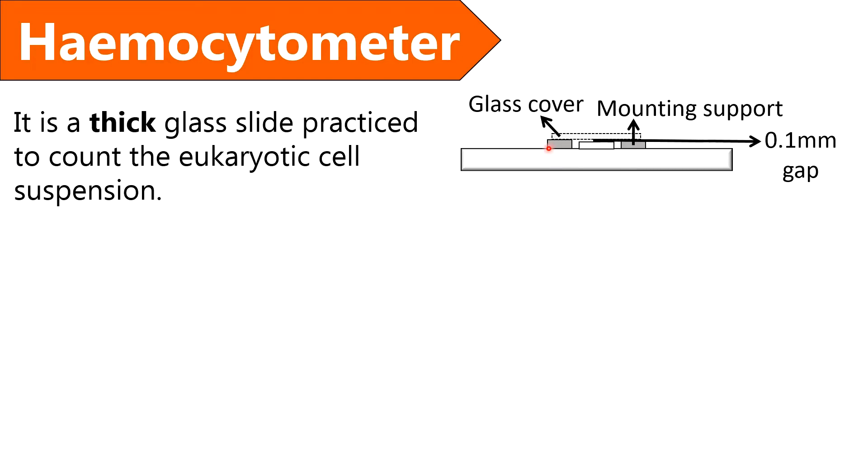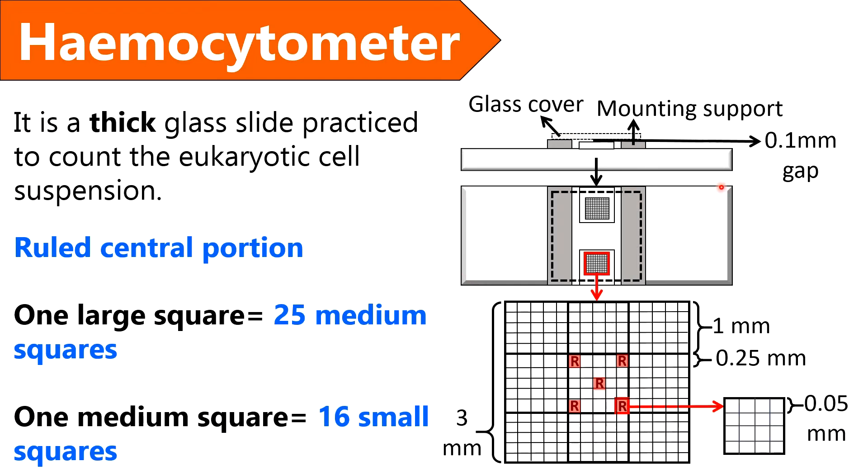Here you can see the elevated portions in the hemocytometer slide that provides a mounting support to the glass cover or coverslip. This is the front view of hemocytometer that has the ruled central portion where the diluted blood sample is loaded, and there is a 0.1 mm gap between the counting grid and glass cover.